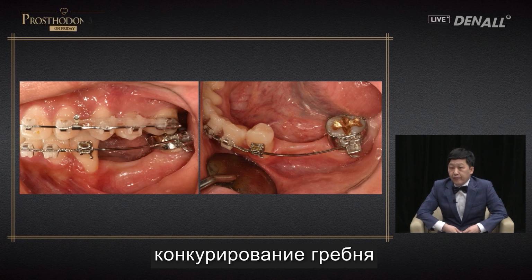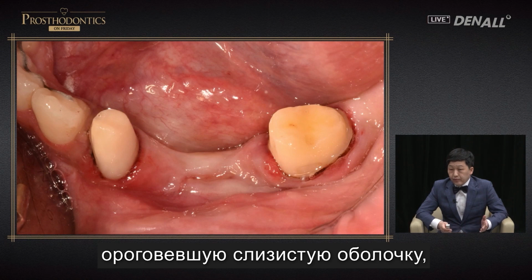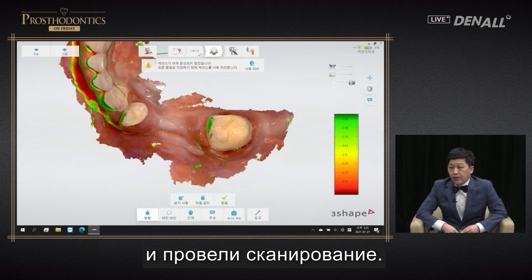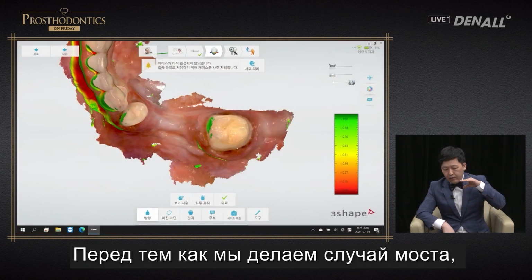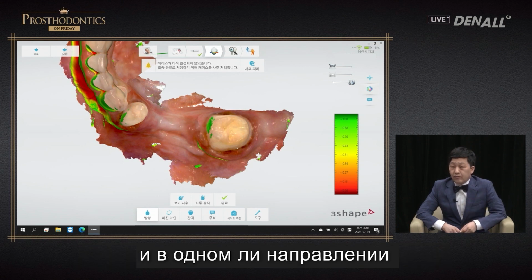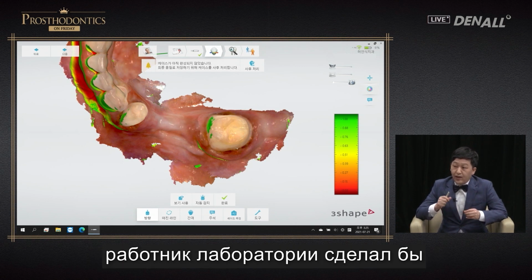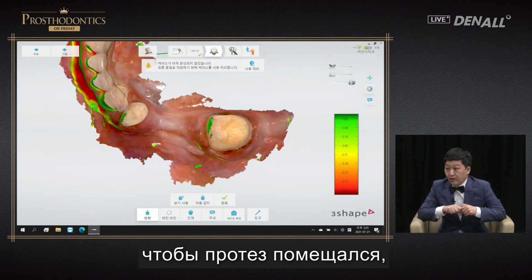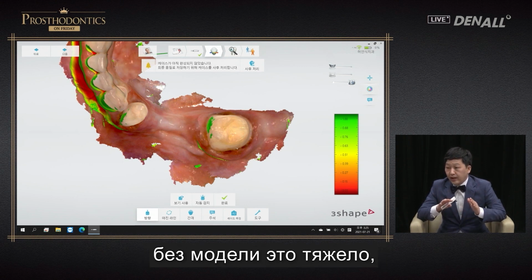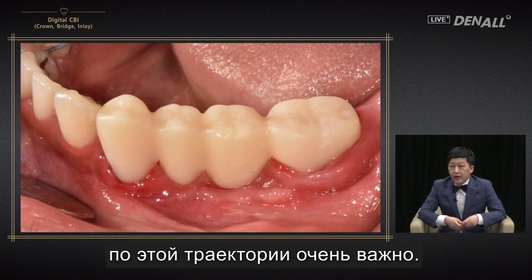Ridge contouring was done, and in order to make keratinized mucosa, soft tissue management was done, prep was done, and scanning was done. Before we do bridge case, we need to check whether path of insertion is made accurately in one direction. In analog prosthesis, the lab technician would do what it takes to make a prosthesis that fits, but in making prosthesis modelless, it's very difficult, so scanning following this path is very important.